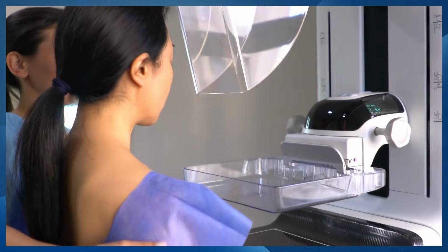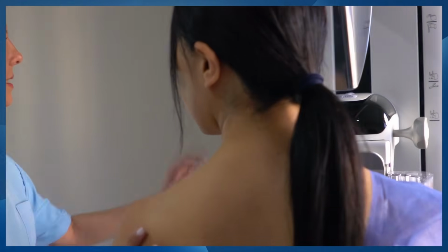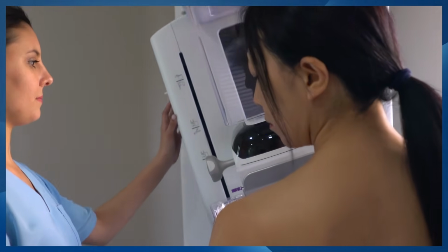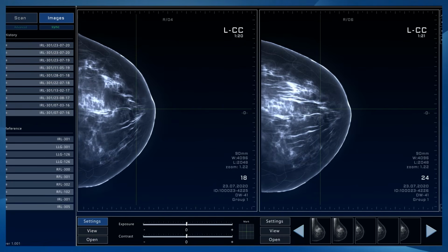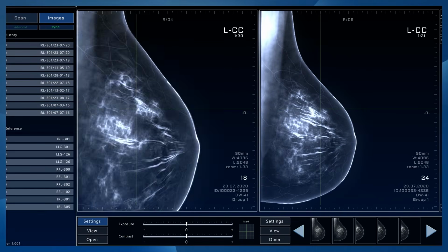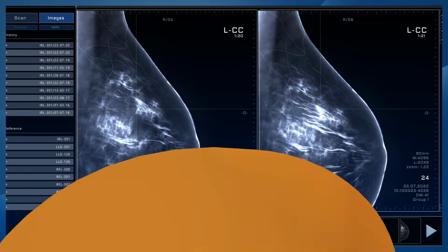As a mammographer, there are many key factors involved in getting the best images possible. The first one is gaining a patient's trust. If the patient's comfortable with us, they're more likely to be relaxed and better talked through the procedure. A second thing is to realize that no two breasts are the same. So our knowledge of how to manipulate both the machinery and the patient, depending on their body habitus, is what's needed to achieve the best pictures possible.